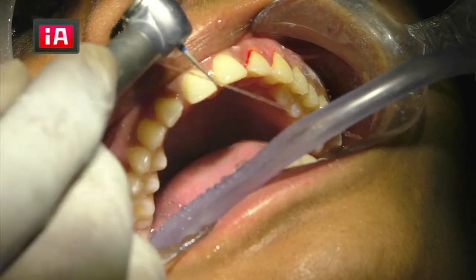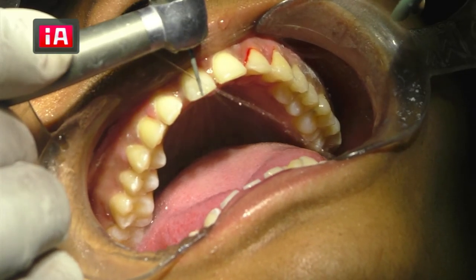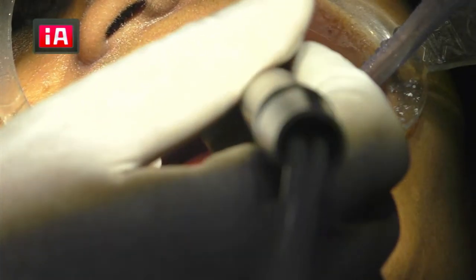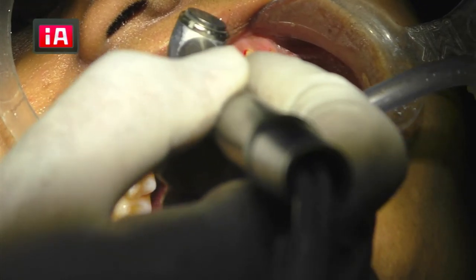Right here, yes, right here. There are two ways. You can make a 1, 2, 3 and then join that up, this is also one way of doing it. Even depth cutting grooves can also be used. Just making it straight. Okay, I'm making it straight.